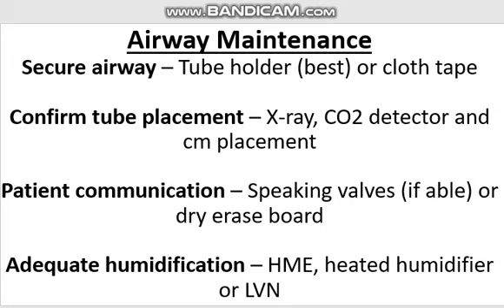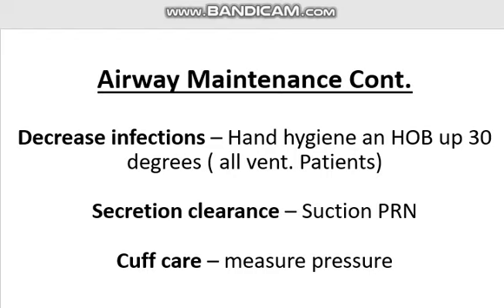And adequate humidification, such as with an HME, a heated humidifier or an LVN. Airway maintenance continued. Decrease infections with hand hygiene and HOB up 30 degrees. This is with all ventilation patients. Secretion clearance is done with suction. And cuff care, which is to measure the pressure.